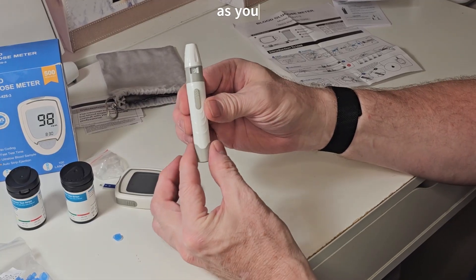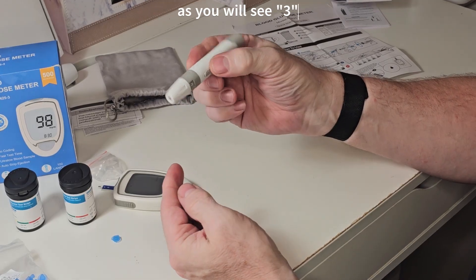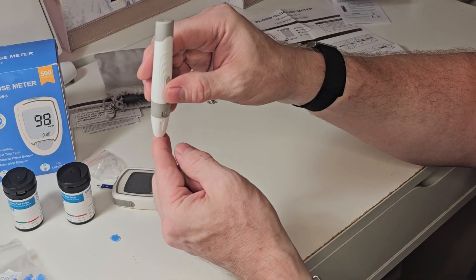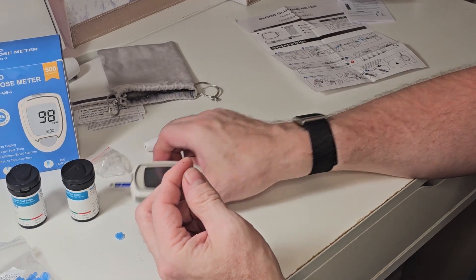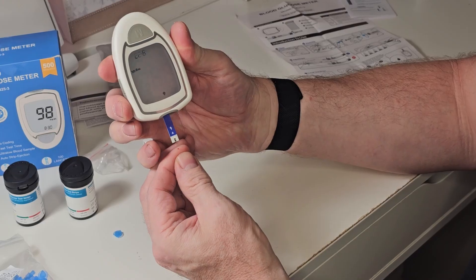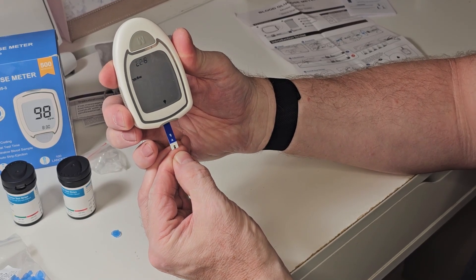Set the lancet to a depth of two, pull this back and you'll hear it click — now you're ready to go. Press that button to release it; it does have a little sharp pain to it. Then squeeze out a little bit of blood and put the meter right there to test.